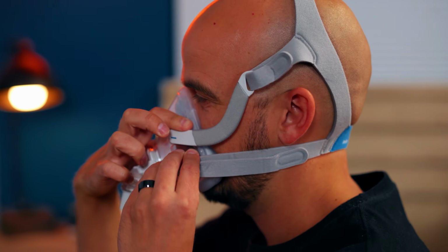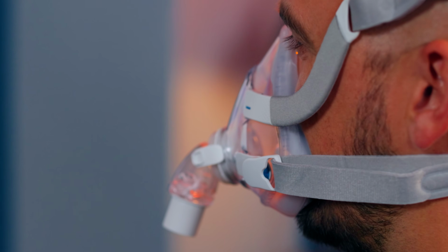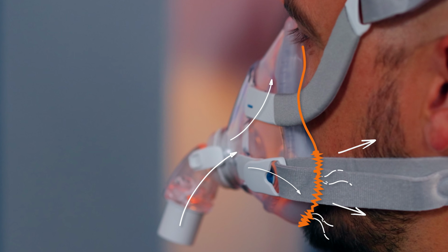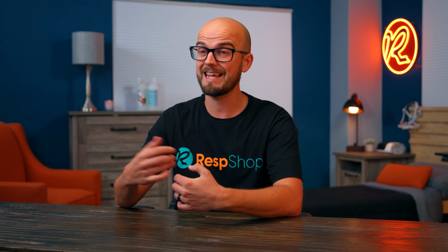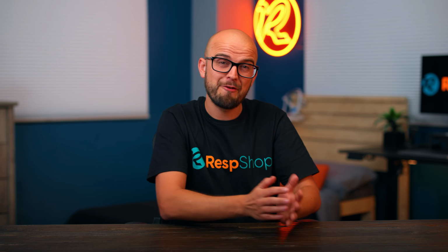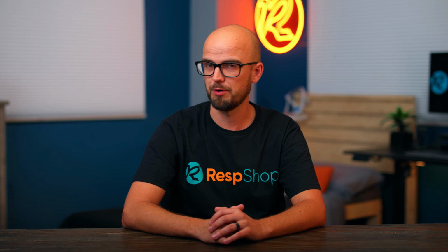Let's start with facial hair. Now, facial hair can cause problems with mask seal. When the area of skin that the mask seals against has hair growing from it, then it can create an uneven surface for the silicone to seal against, which creates gaps in the seal, which then causes leaks. The thicker and more stiff the hair is, the worse the problem. So, here are 4 hacks if that's a problem for you.